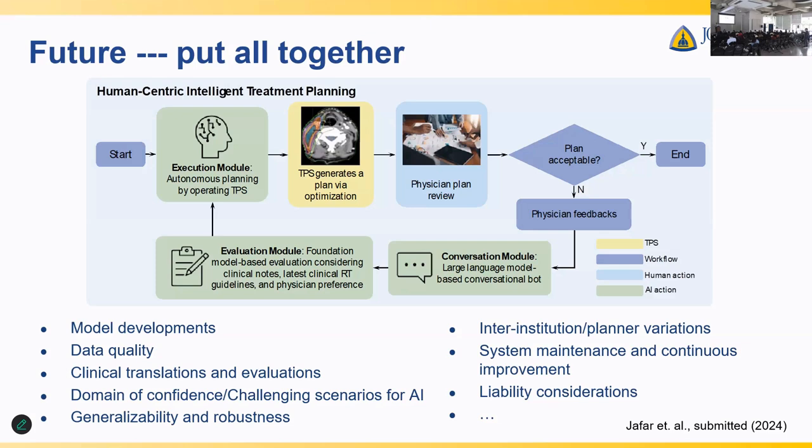Okay. So my guess is that if you use reinforcement learning, you probably need to retrain every time you switch to a different organ. I'm just curious whether you can train a reasoning model, like a DeepSeek reasoning model or Google's deep reasoning model, so that you can get one model for all the organs altogether.